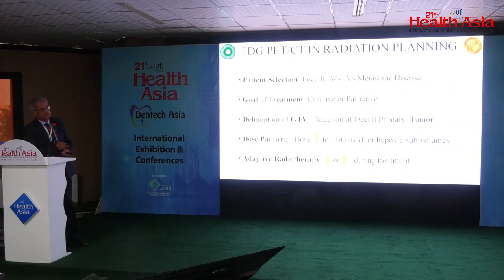The FDG PET-CT has really entered into the radiation oncologist arena, and they are working together now because the FDG PET-CT helps them to select the patient, whether the patient is having a locally advanced or the metastatic disease, the plan should be curative or the palliative.